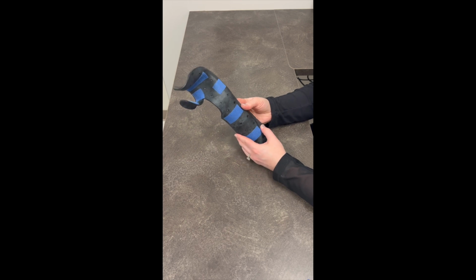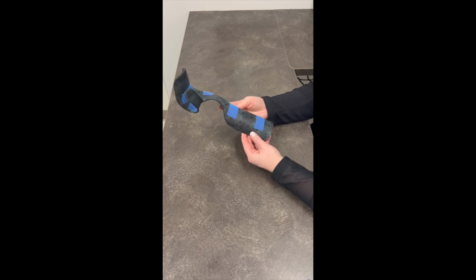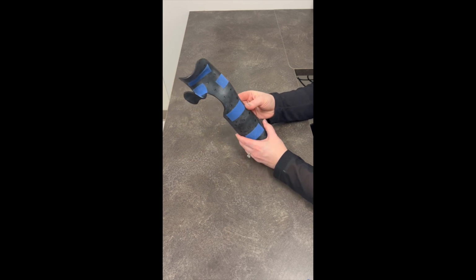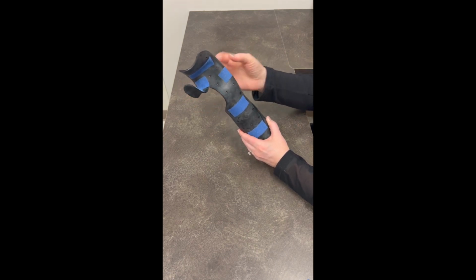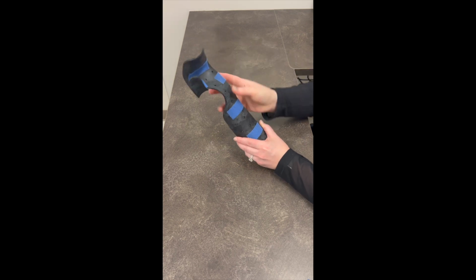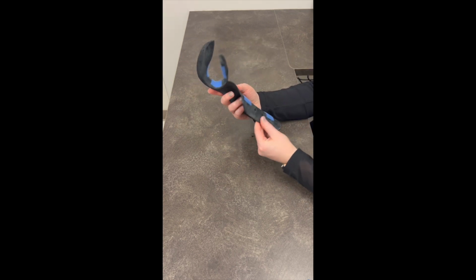Here's the orthosis after it has been trimmed, and I went ahead and applied the hook Velcro. So we're gonna have a strap on the wrist, one around the forearm, one that goes around the dorsum of the hand, one around the fingers, and then one around the thumb.